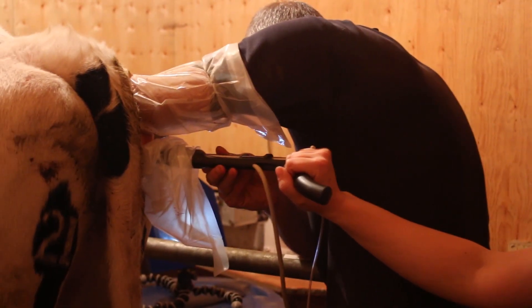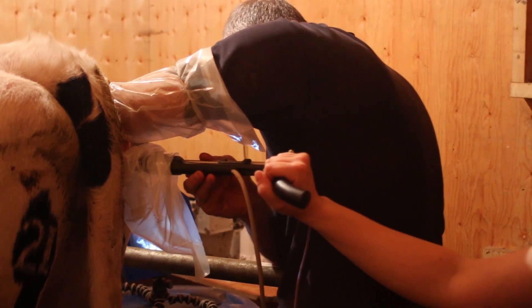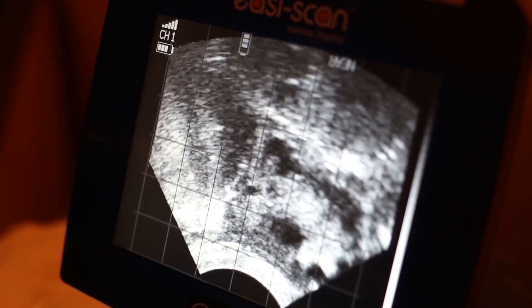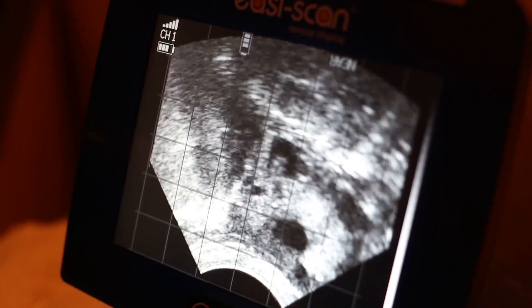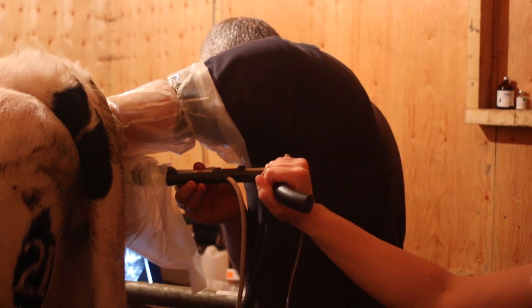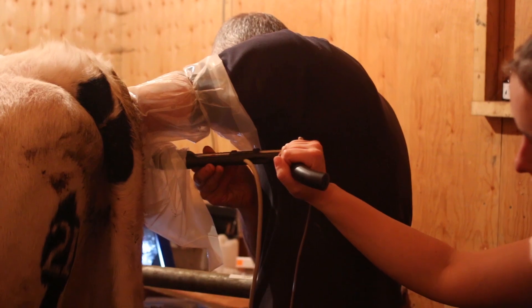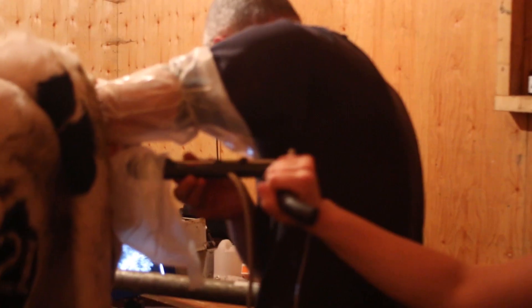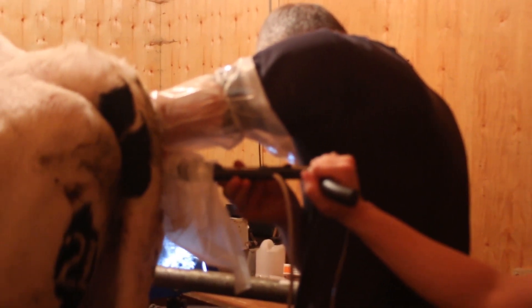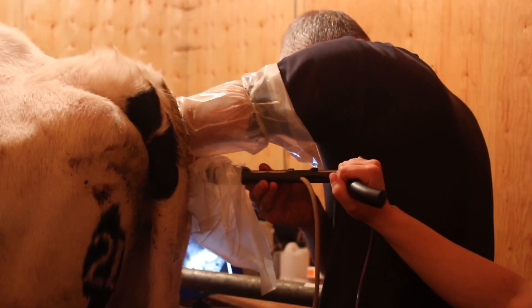What I'm doing with my hand is gently holding on to the ovary and pulling it around such that the follicle comes to lay just where the needle emerges, so I can accurately penetrate the follicle and remove the follicular fluid and hopefully the oocyte with it. The quicker the needle gets directly into the follicle, the more likely you are to retrieve the oocyte. If you try and go through too much ovarian stroma, there's a danger you go either in front of or behind the follicular structure.